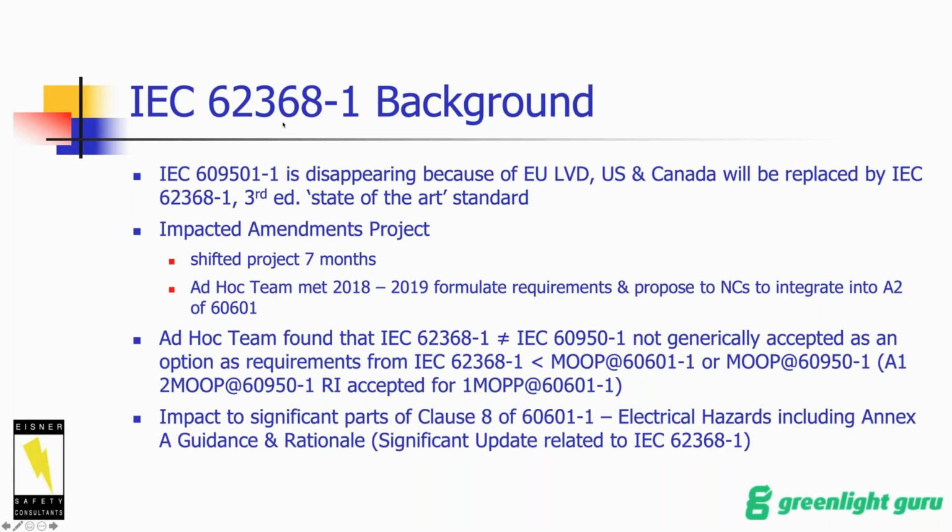So let's get into some background on 62368-1. So the ITE standard 60950-1, and I have a typo there, there's an extra one in there. That 01 shouldn't be there, it should be 60950, is disappearing because of the EU low voltage directive. Specifically, at the end of this year, December 20th, it goes away. And so the US and Canada are following suit, and I don't know their exact timeframes, but I think it's the end of this year, maybe it's next year with them. It will be replaced with 62368-1 third edition, the state-of-the-art standard.